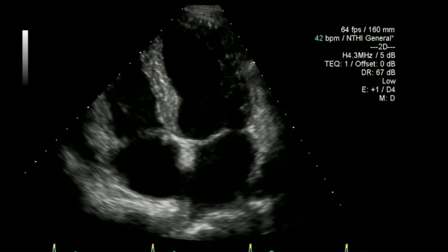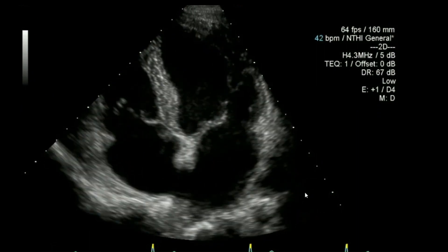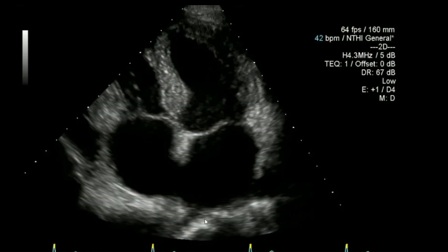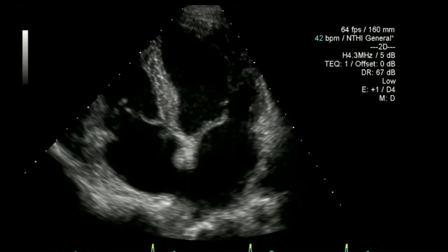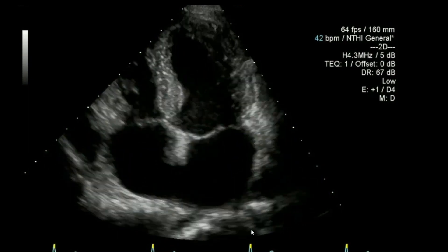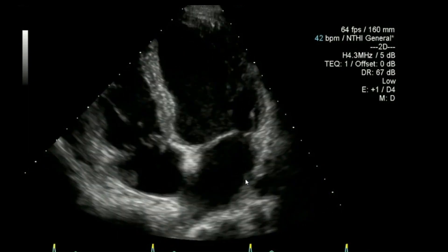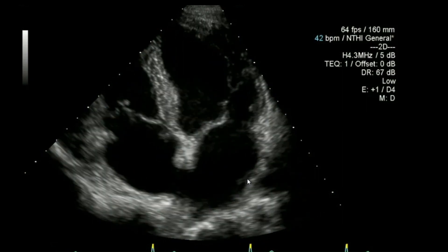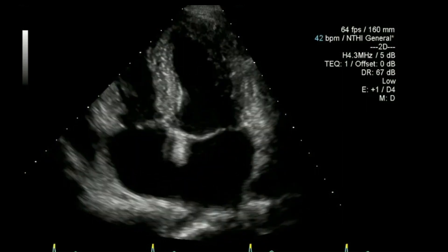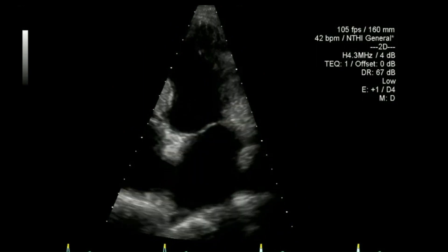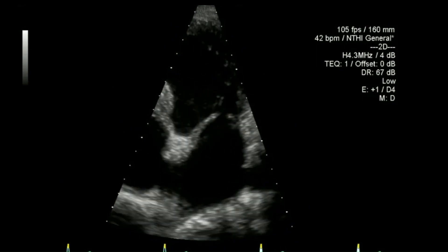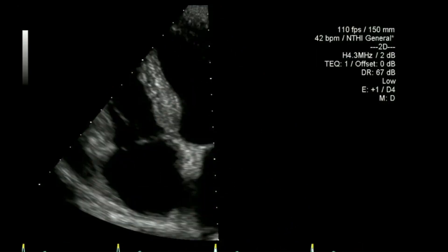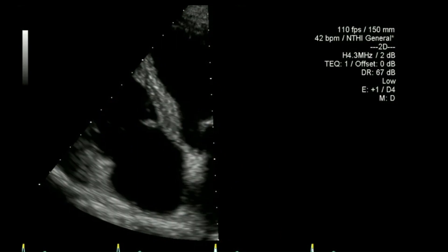Next, coming down to the four chamber view — again one to two centimetres behind the heart. Often I'll look deeper initially just to check there's nothing there. If I can open up both atria I'll measure them in that one view, or if I can't open up both adequately together I'll measure them separately.